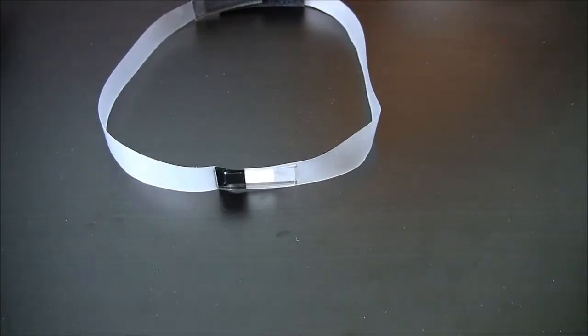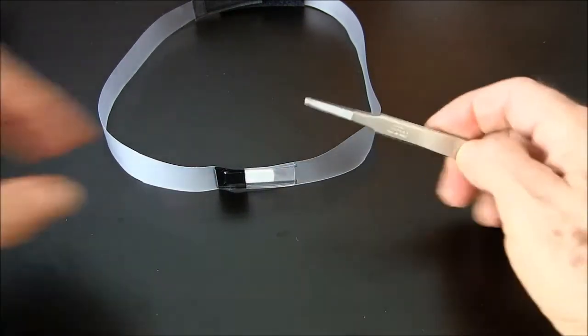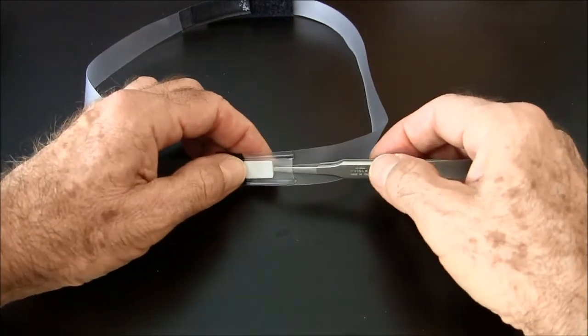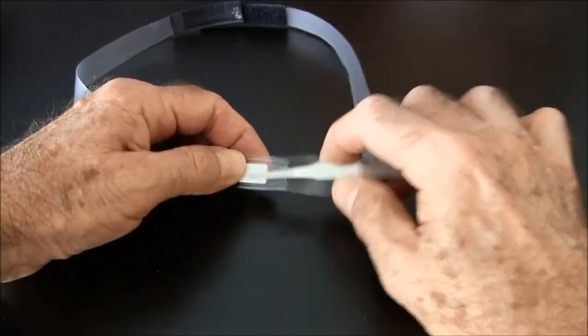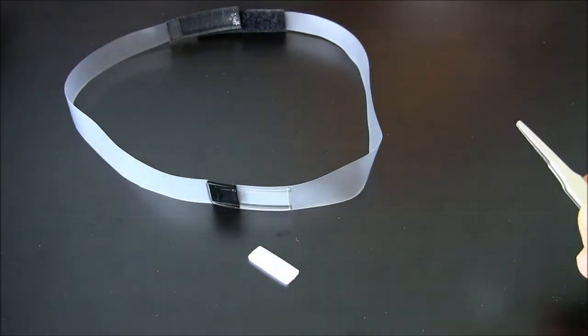The TLDSHBE1P, or TLD headband for lens of the eye dosimetry with a PTFE insert one pocket, is shown here, and you can see the extra PTFE insert compared to the no-insert version. The PTFE insert may be removed and reused as part of the whole program.